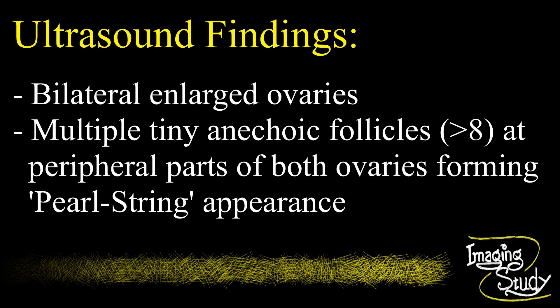On ultrasound, ovaries are enlarged bilaterally. Multiple tiny anechoic cystic follicles are noted at the peripheral parts of both ovaries, forming the typical pearl string appearance.